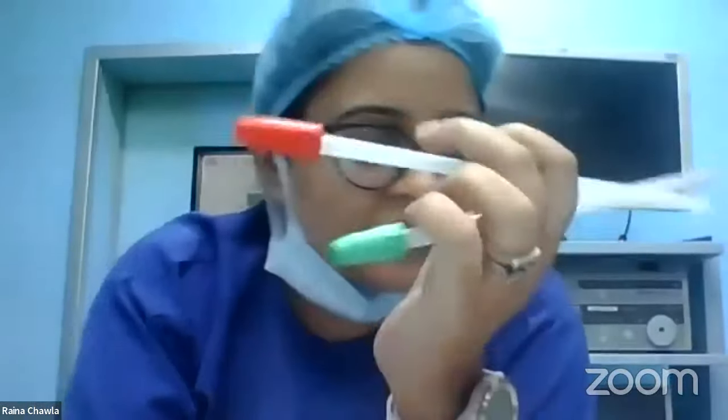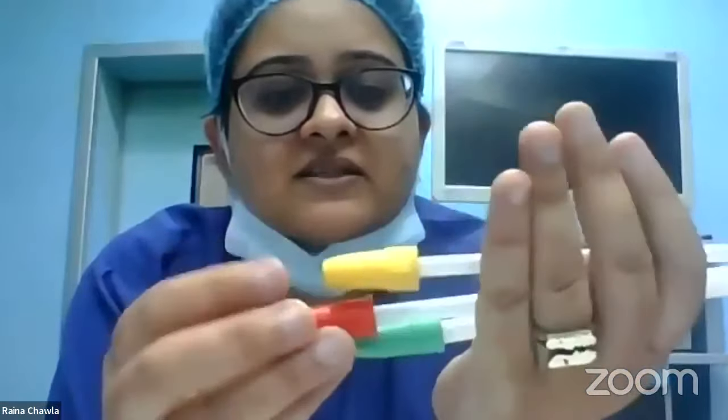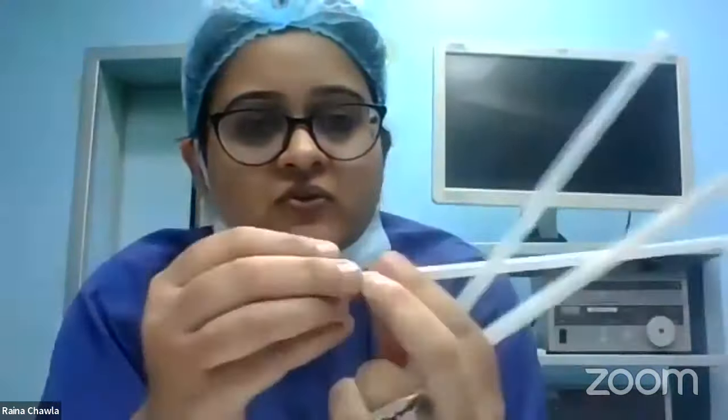Now these are color coded. I have 3 of them here. They are color coded depending on the size, but the size number is also mentioned on the packet. This packet is white color coded, and you can see the size written here is 10. So you use this. Now what is this attached to? It's attached to a suction apparatus, either an electrical suction apparatus or a manual vacuum apparatus. The electrical machine is usually the same suction machine which you see in your labor room or in the OT. Or you can use this.